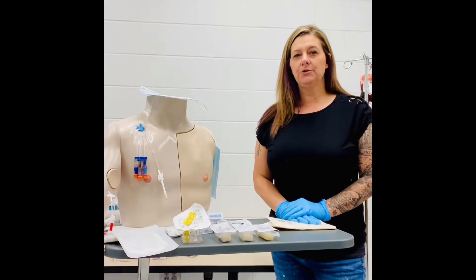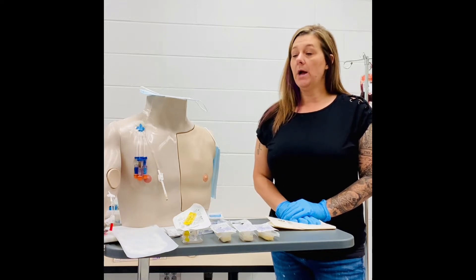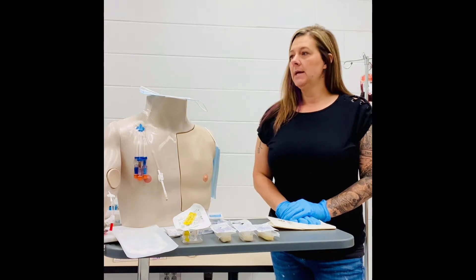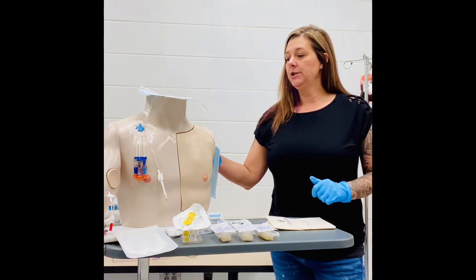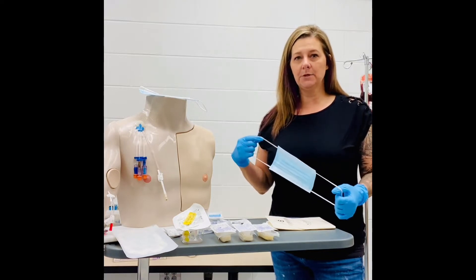Hello, this video is to show you the skill of accessing a PortaCath. To begin with, we always want to introduce ourselves to the patient and verify the patient's identification with two different identifiers. We always want to verify the physician's order prior to beginning. After you've done that, you want to assess your patient and ensure they don't need anything prior to beginning the procedure.